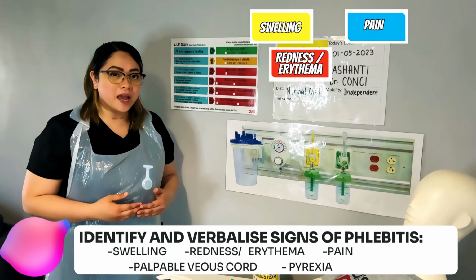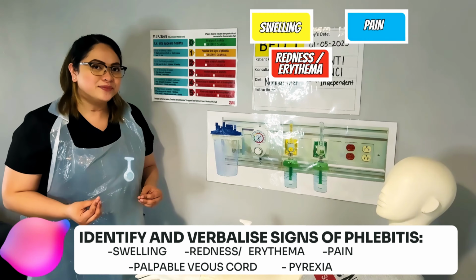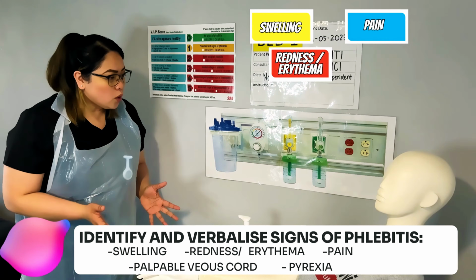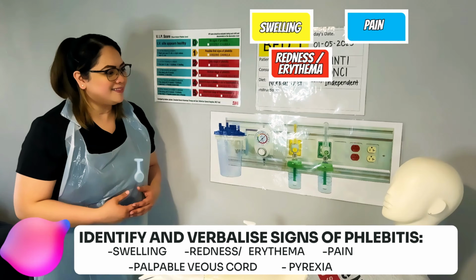Should the patient ask for pain relief, I'm going to ask the examiner that I'm not going to go with the procedure without giving it, okay? So, Ashanti, since you said you don't want any pain relief, would it be okay if I just go with the flushing? Yeah, sure.